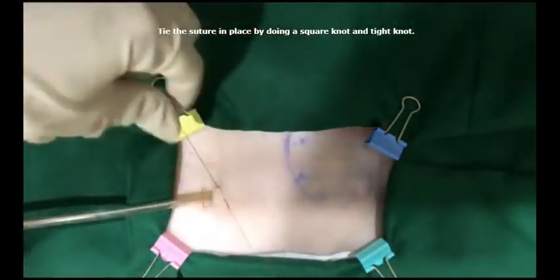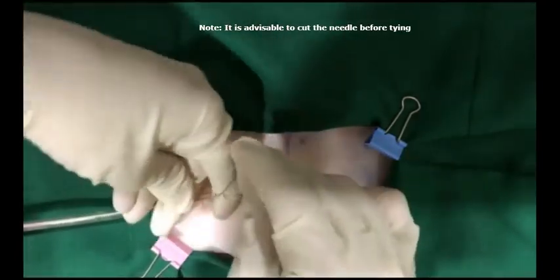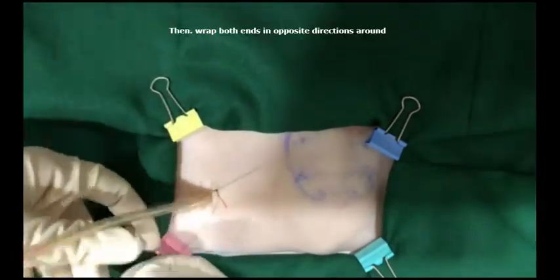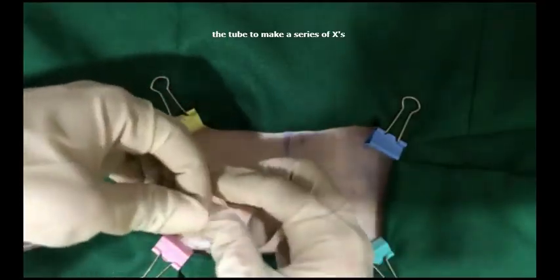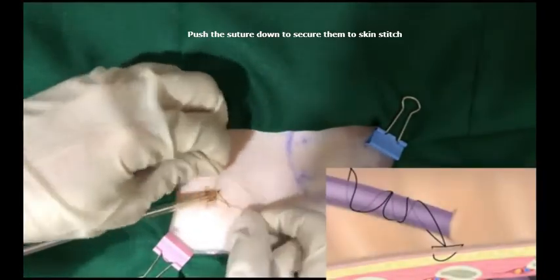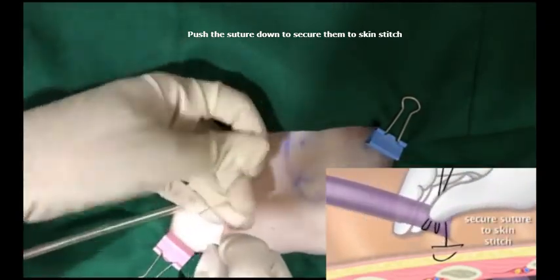Tie the suture in place by doing a square knot and tight knot. Then, wrap both ends in opposite directions around the tube to make a series of X's. Push the suture down to secure them to skin stitch.